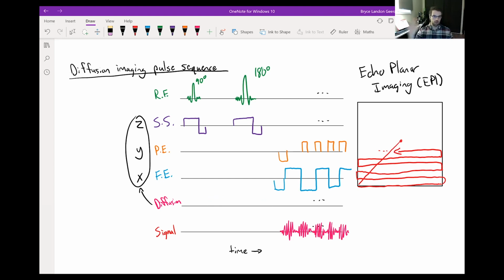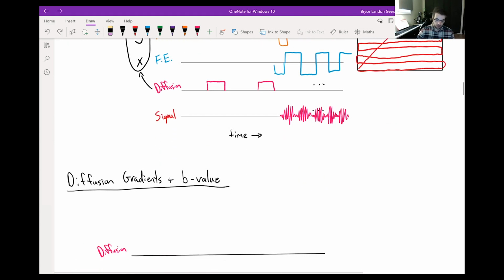And then when you actually acquire a diffusion-weighted volume, you can see what the change in signal is from reference to diffusion-weighted. And then you can judge how much water has moved in a given region thanks to that comparison. That's referred to as the subtraction method, where you just have reference state minus active state, or diffusion state in this case, and you look at the difference between those images. That's going to come up in fMRI and ASL as well, that subtraction method.